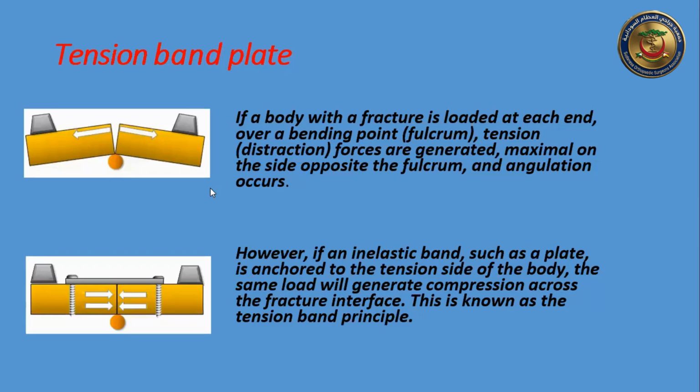But sometimes you may need it in a pediatric patient with open physes above and below, not amenable to elastic nail or intramedullary nailing. So you can plate it. Apply the principle of tension banding if the fracture is transverse, with no comminution to the medial side, or no comminution in the fulcrum or compression side.